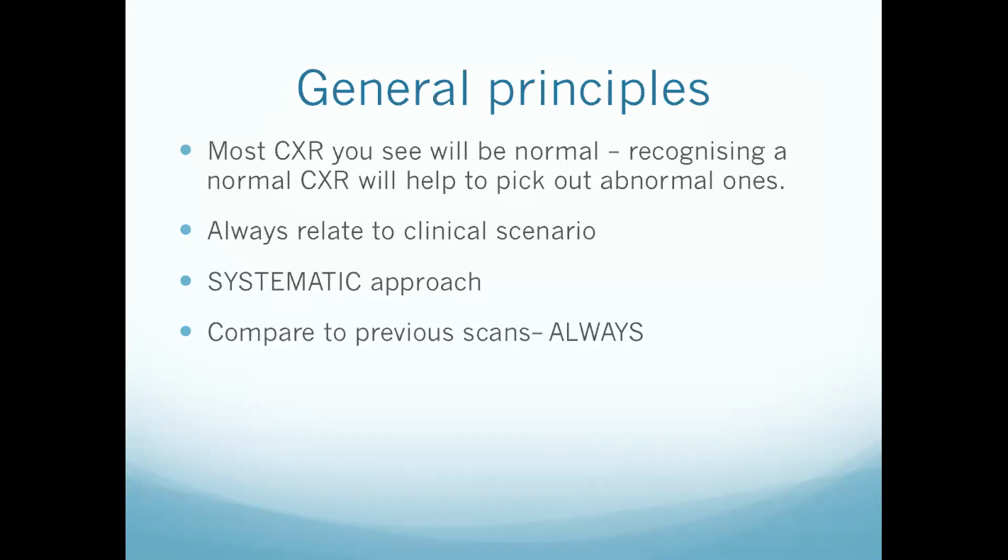And what I'm going to go through is very important to have a systematic approach in exams or when you're first on the wards and getting grilled by a consultant. The main thing they'll be looking out for is that you do have a systematic approach to it, so that you cover all your bases, even if you're not coming to the right diagnosis. At least you're showing how you're working it out and going through it properly. Another important thing is to always compare it to previous scans that they've had. Ideally, you'd like to compare to previous chest X-rays if they've had them before, but also if they've had a previous CT chest, you can compare it to that as well.